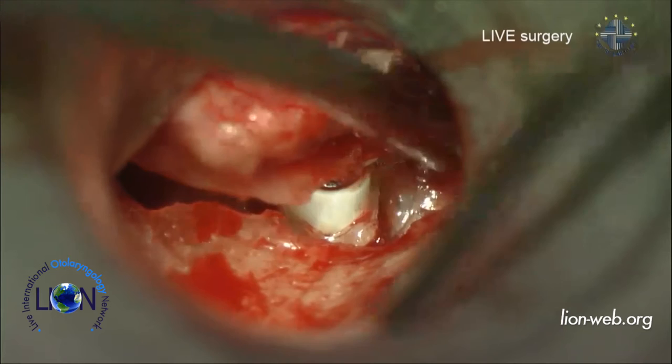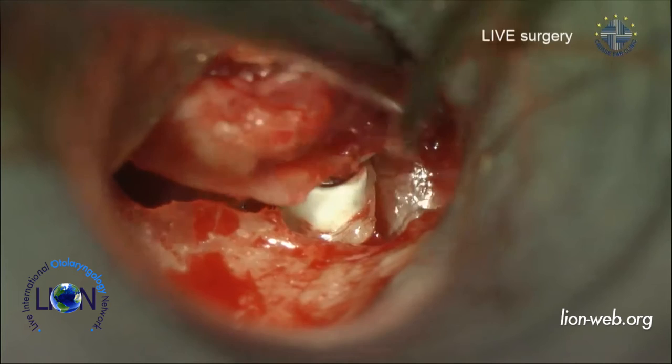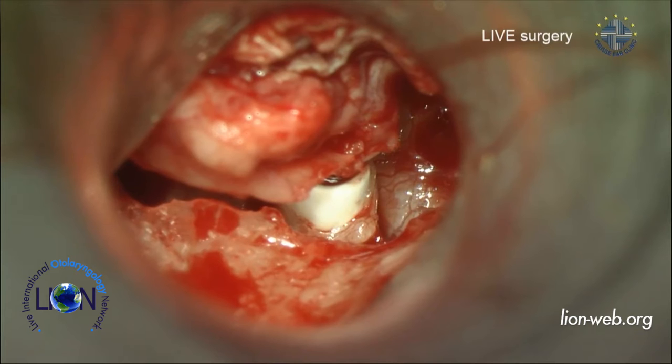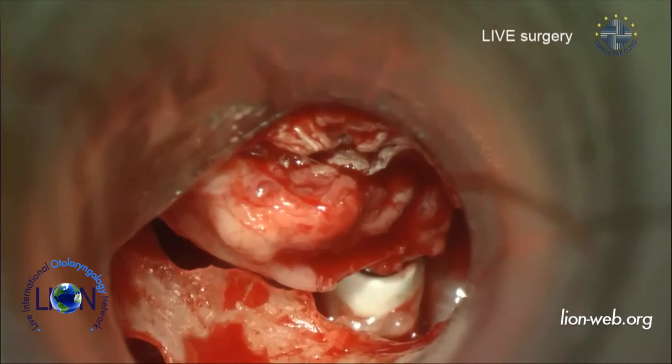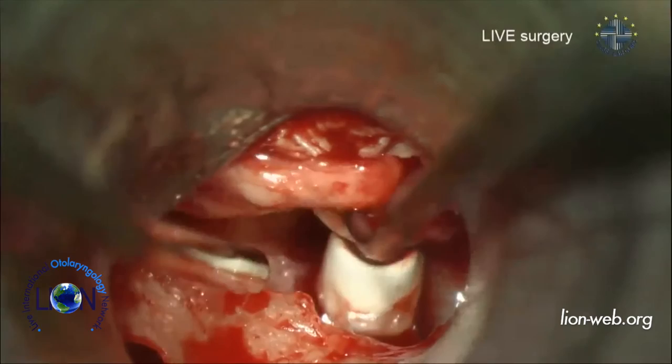Remember, when she had a conductive loss, did you ever do a myringotomy to see if she had serous otitis or fluid behind the eardrum, or could you tell? What do you mean exactly? If I have a conductive hearing loss, what is the question? When she had a conductive loss, when it was big, did you... I know what you mean. No, there was no fluid behind, but we didn't do it. But the tympanogram was fine, and then the clinical examination too. No, sure.